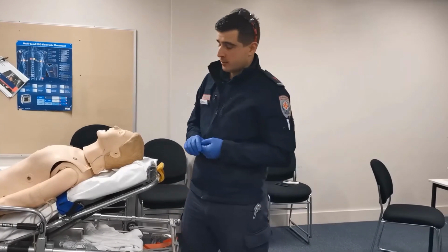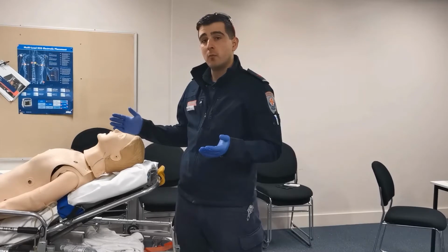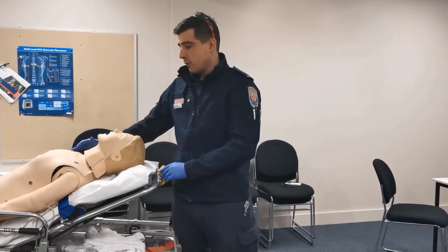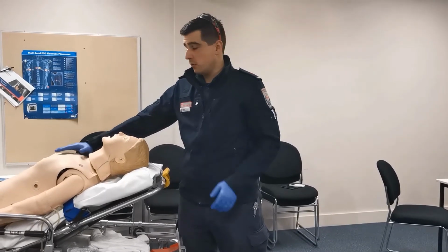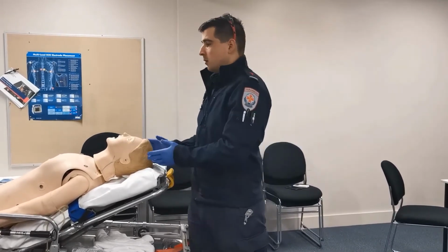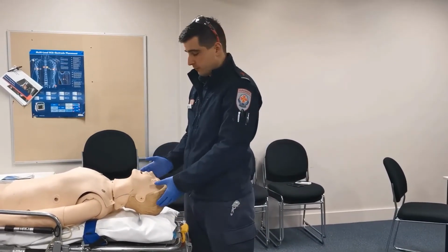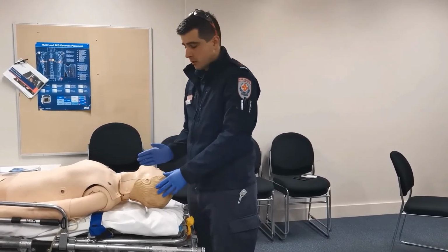Once we've located our target insertion sites, we have to engorge the external jugular vein to allow ease of access. Now we can't obviously put a normal venous tourniquet on or we'll choke our patient. So there's a few ways that we can distend our vein. If appropriate and if able, allowing the patient to bear down as if completing a Valsalva maneuver will increase the central venous pressure and in turn increase the jugular vein pressure. You can raise the patient's legs, or, most clinically appropriate and to reduce the risk of an embolus, lie the patient as supine as possible. With C-spine precautions in mind, a 45 to 60 degree head tilt to the opposite side will allow for ease of access when inserting.